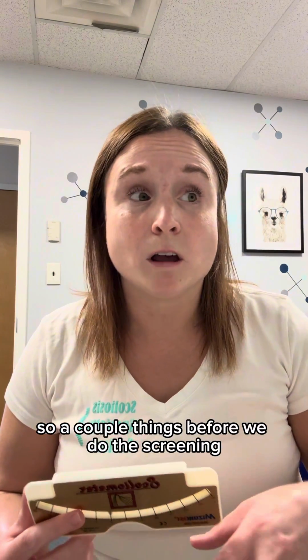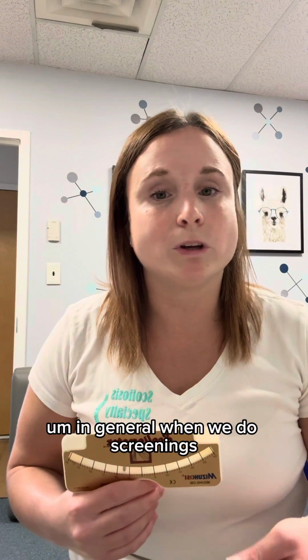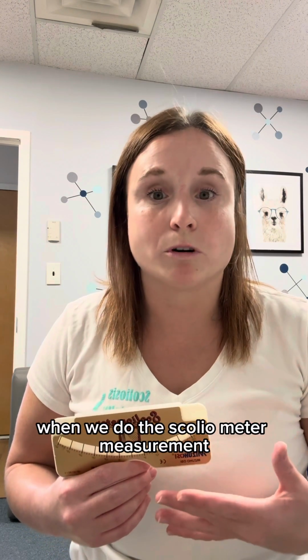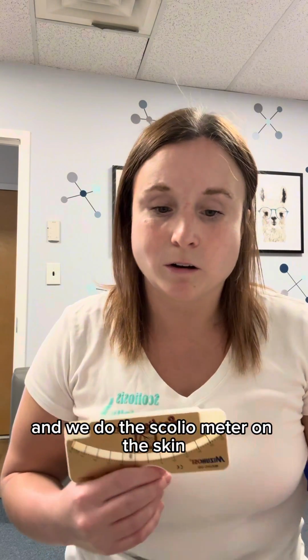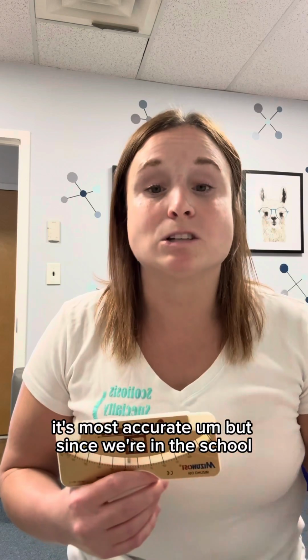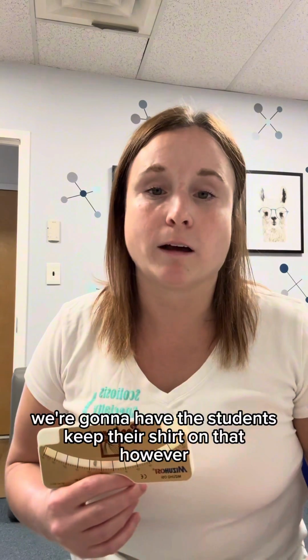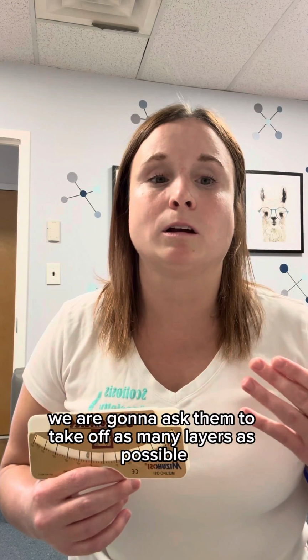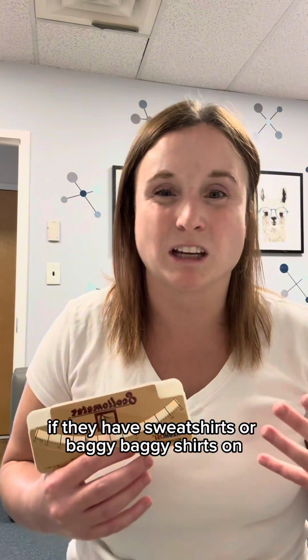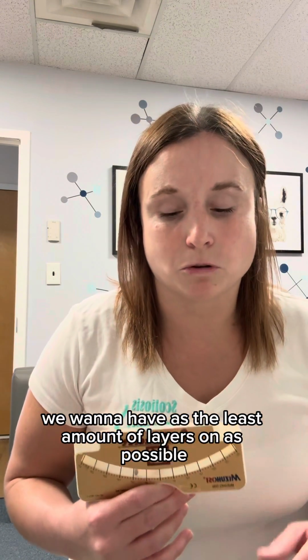So a couple things before we do the screening. Obviously, the first thing is we need to ask them permission. In general, when we do screenings, when we do the scoliometer measurement, we have them take their shirt off, and we do the scoliometer on the skin. It's most accurate. But since we're in the school, they don't really have any dividers or any privacy screens. We're going to have the students keep their shirt on. However, we are going to ask them to take off as many layers as possible. If they have sweatshirts or baggy shirts on, we want to have the least amount of layers on as possible.